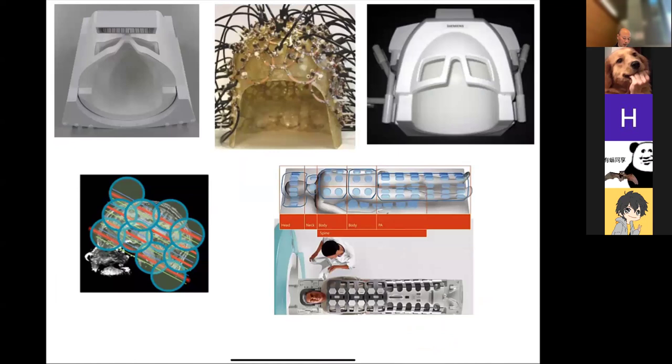We talked a little bit about how quickly using multiple coils happened. Over the course of about 20 years, it went from buying a system with one coil being standard, to now buying a system with 32, 64, or 128 coils, which are all fairly standard options, right?